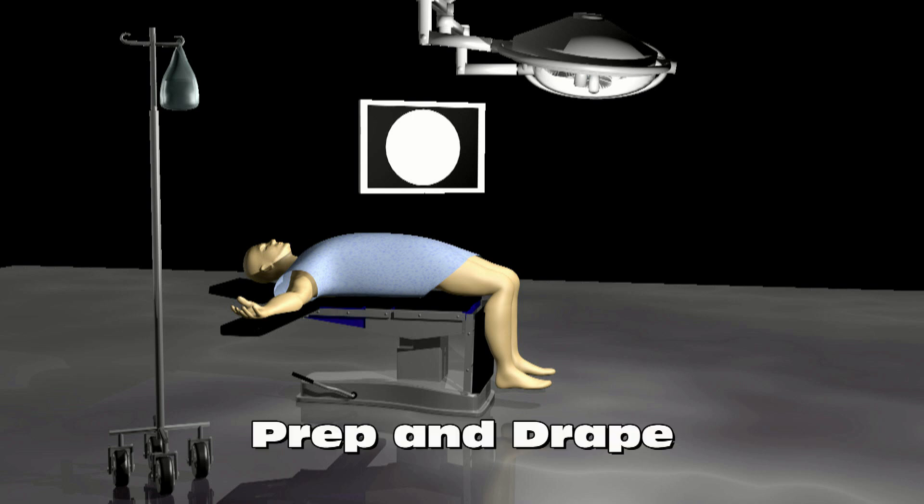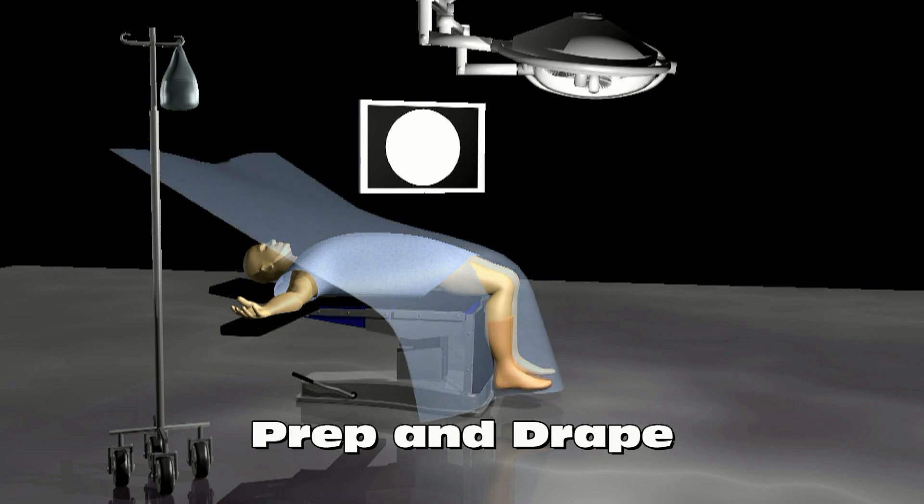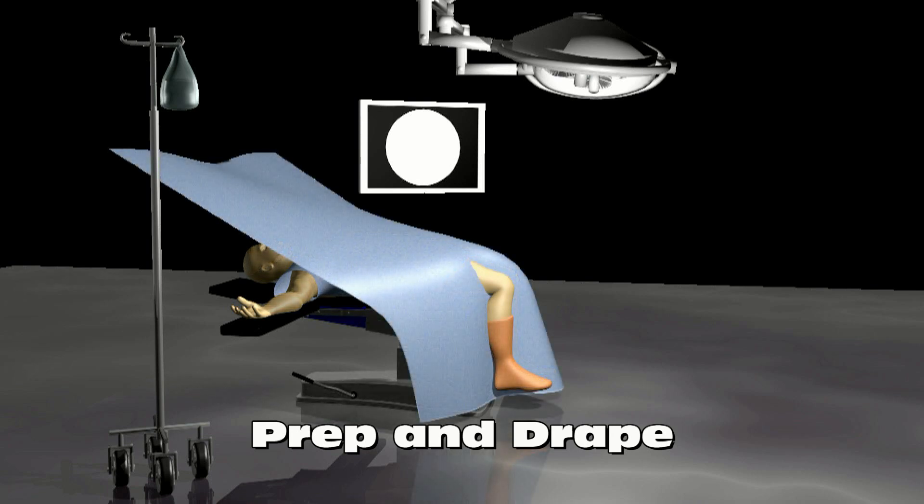The knee is thoroughly cleansed and sterilized. Then the patient is draped in sterile drapes to avoid contamination of the operative site and prevent infection.